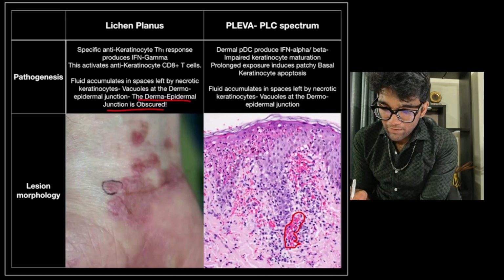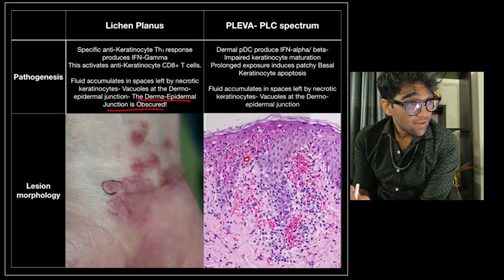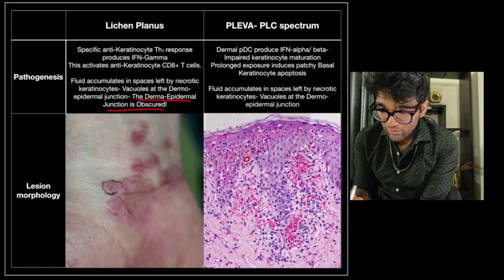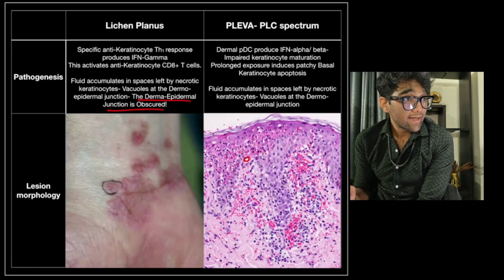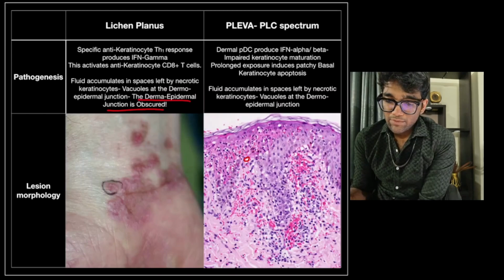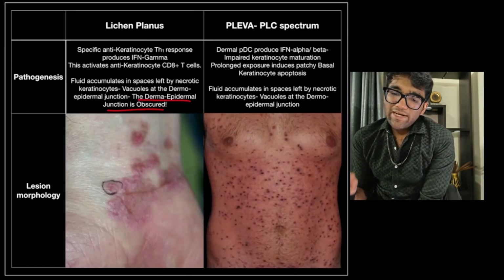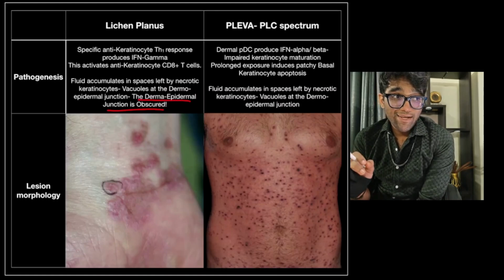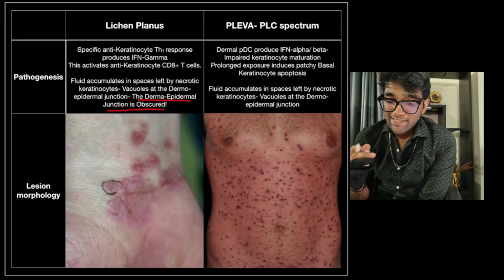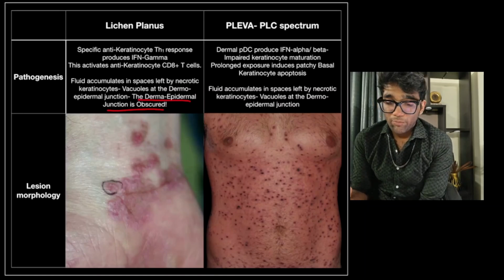Now if you look carefully, there are small holes present at the dermoepidermal junction. These are the holes, and this is the pathognomonic finding in vacuolar interface dermatitis. Although here there is some lichenification. So the lesions look like this, again well demarcated, but because there is lichenification, they are not red, they are violaceous. Because that lichenified skin essentially enables Rayleigh scattering to occur, and therefore the red components of the light are scattered away.